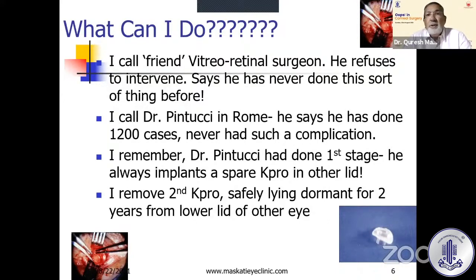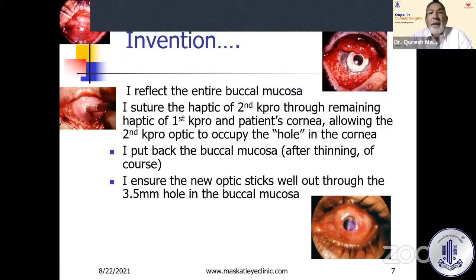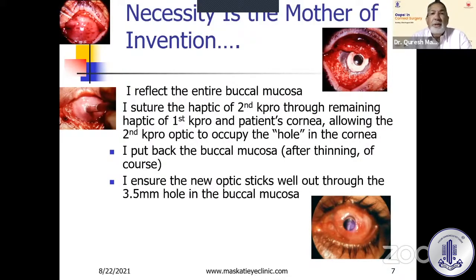I remembered that whenever Dr. Pintucci did demonstration surgery, he would put two K-PROs because they were owned by him and he didn't have to pay for them — so he would put a spare K-PRO like a spare tire in the other eyelid. Now I removed the second K-PRO, which was safely lying dormant for two years in the lower lid of the other eye. I reflected the entire buccal mucosa and sutured the haptic of the second K-PRO through the remaining haptic of the first K-PRO using 5-0 Vicryl sutures, securing it through the cornea.